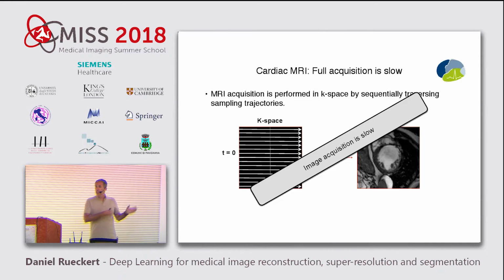It's all great. But this is not a single heartbeat. This is approximately 10 to 15 heartbeats, and the image is reconstructed as an average of these 10, 15 different heartbeats. And it doesn't look very blurred because the ECG gives you enough information to trigger at the right moment to acquire more data. But the problem is, you just have to wait for 15 heartbeats to get this image instead of just one heartbeat. So it would be much nicer if we can image very quickly and get all the information in one single heartbeat. And why can we not do this?